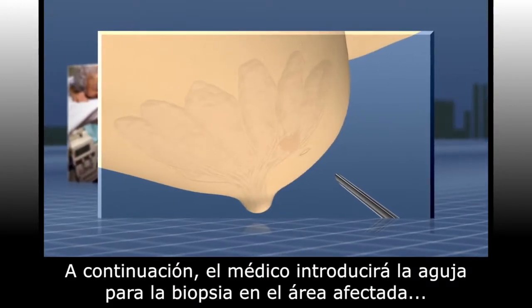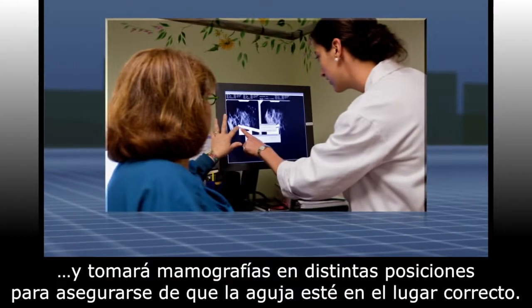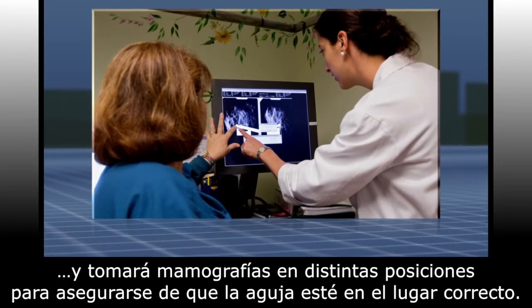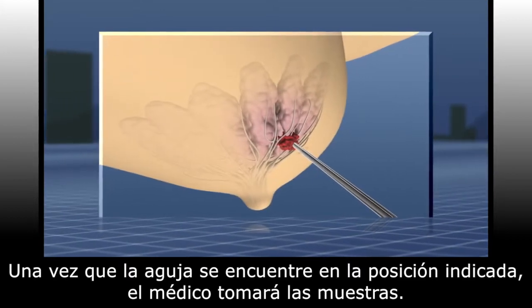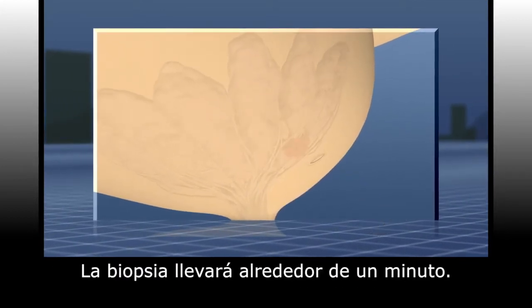An incision so small that it doesn't need stitches will be made into your skin. Your doctor will then insert the biopsy needle into the target area, taking mammographic images at multiple points to ensure the needle is on the right track. When the needle is in position, your doctor will take the samples. The actual biopsy takes about one minute.